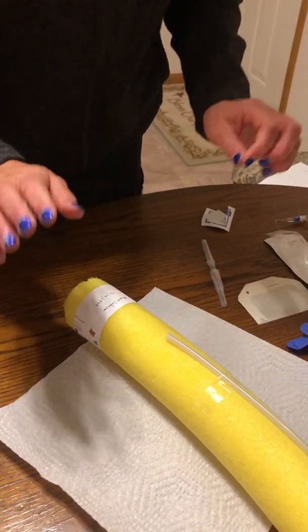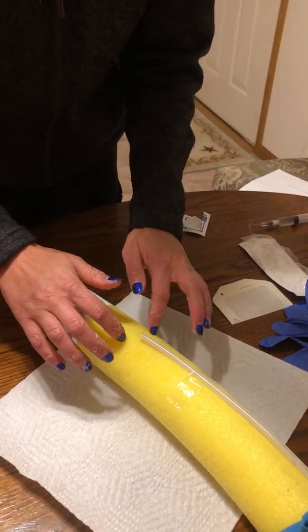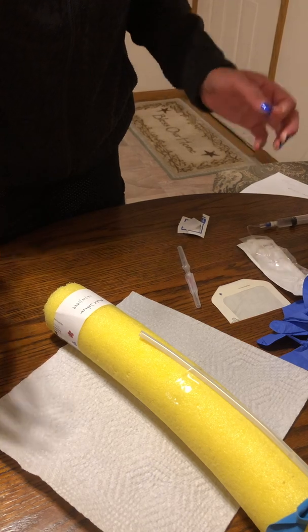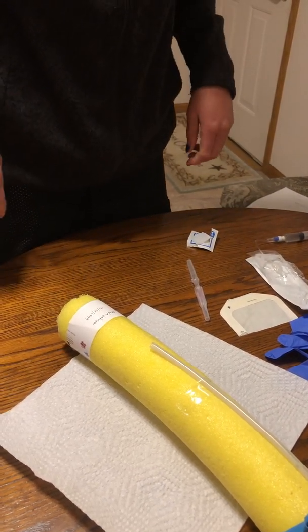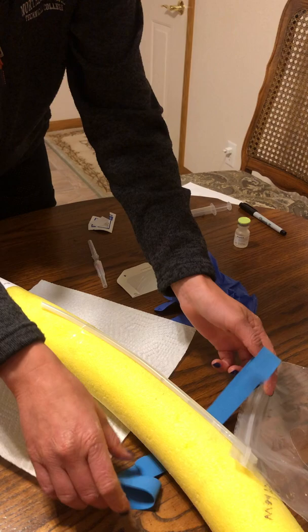So their extremity is dependent, and I can tell that I'm palpating and I can feel the vein right now. To feel the vein better, you might want to put a warm compress for 5 minutes on the site. Okay, good. So now I'm going to release the tourniquet. You don't want the tourniquet on for more than 2 minutes.